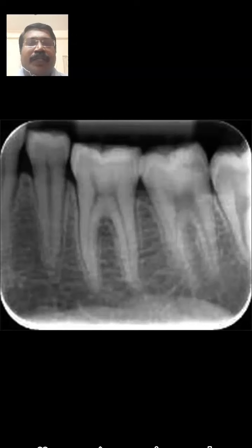So the main strategy of interpreting a normal dental radiograph is to assess the presence, number, relative size, shape and direction of the teeth and the roots, and identify dental tissues, anatomic areas of interest and surrounding structures. This should be the main strategy. All findings should be interpreted with consideration of the age, size and gender of that particular patient. Let us see how we can interpret each dental radiograph in detail.